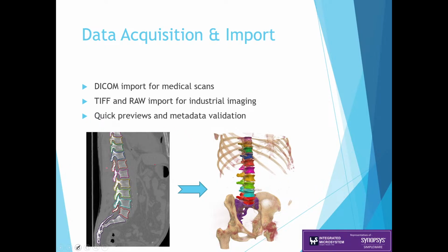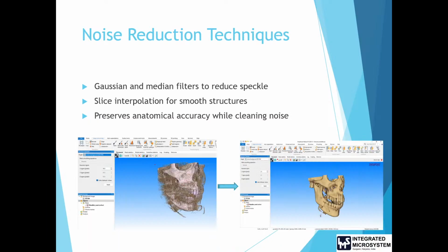In this particular case that is shown, we had used a spine auto CT segmentation, where it has segmented out the particular spine data into vertebrae and sacrum, renaming it as V1, V2, V3, V4, all the way up to the sacrum part. We can isolate each and every part. So for example, if we are working on the lumbar spine, we can just identify that part, isolate it, and work on that specifically.